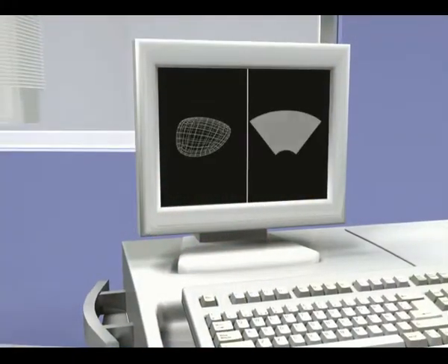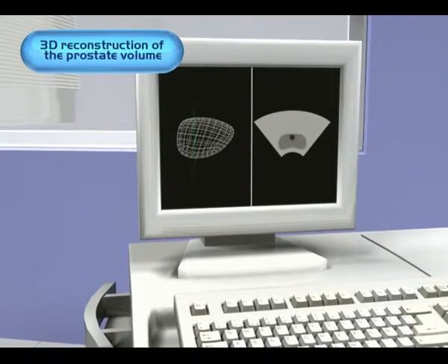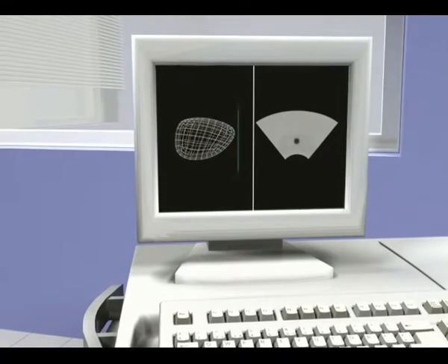The computerized system will then recreate the prostate in three dimensions to enable the surgeon to plan the treatment on the screen and to program the robot by defining the area to be treated.